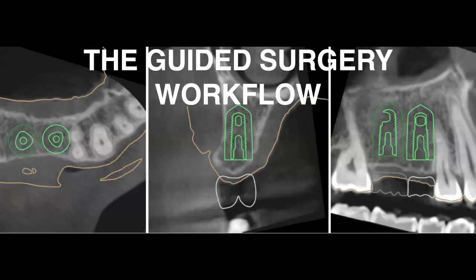They'll scan the site, they'll scan the area where the tooth is missing. In this particular case, we were at the site of the premolar and the molar. They can scan that for you, and then they can go ahead and wax it up for you as well. Now, the wax up can be done, normally the lab will do it on the same software that they are using to fabricate their guides, and there are many softwares out there for that.